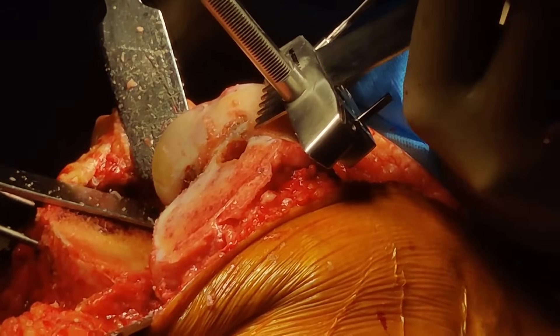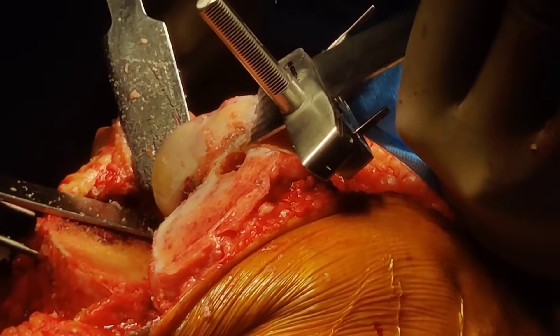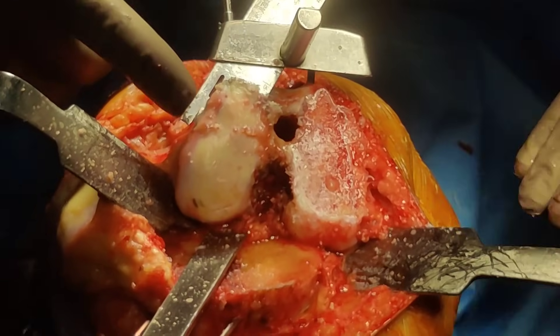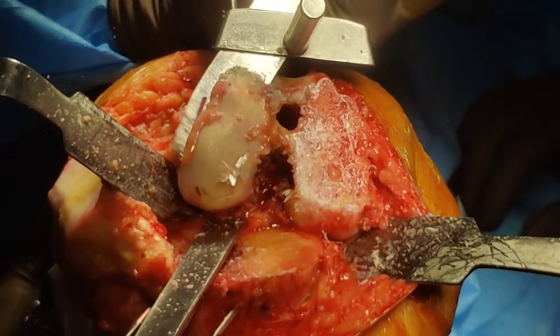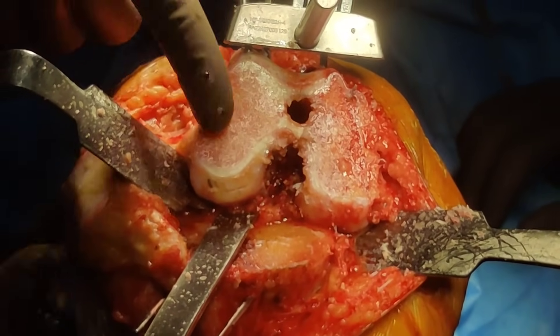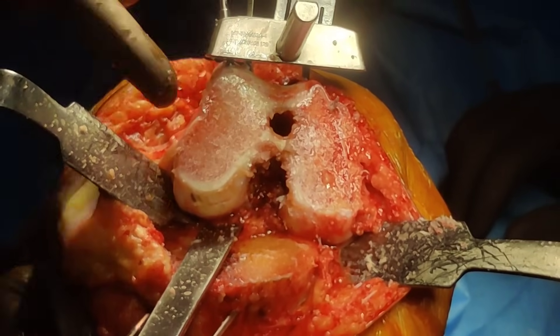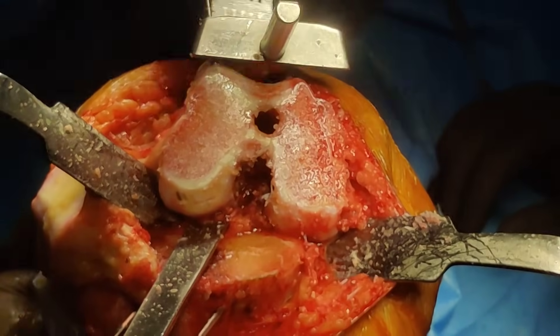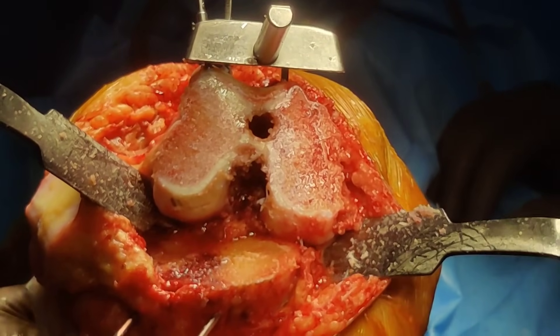The same way we are going to come on the outside — come out here, do the outside first. This way you will never have bone loss. Otherwise you start from inside, you break, and in a small bow you lose bone. So this is our distal femur cut done.